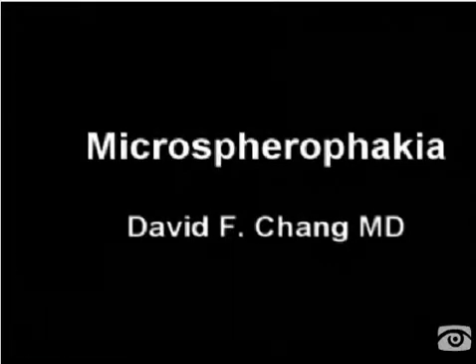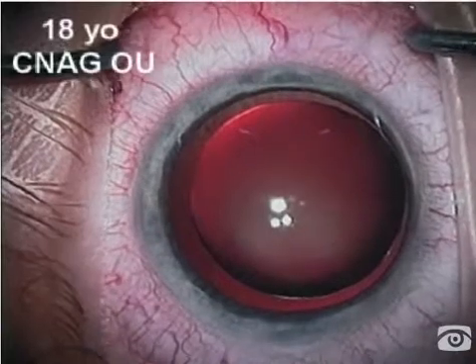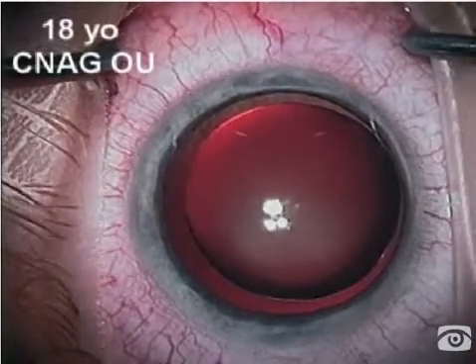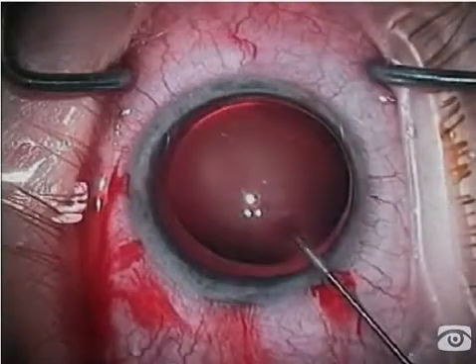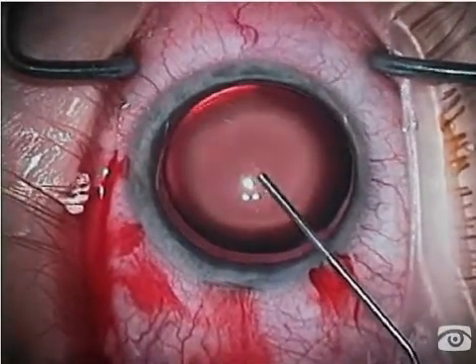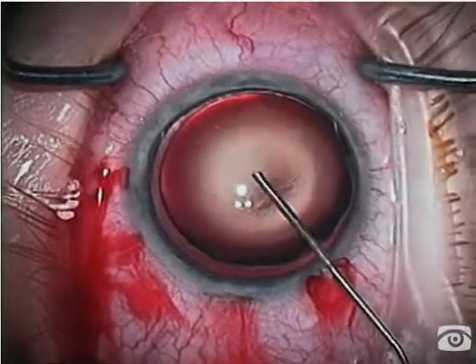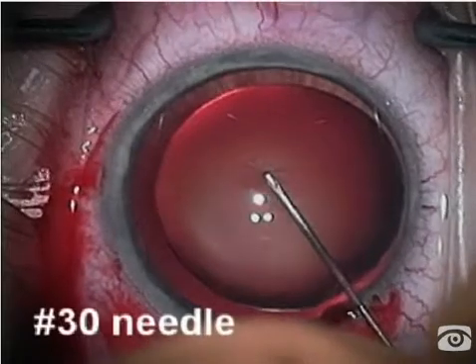Lens removal was scheduled on this 18-year-old high myope with chronic angle closure, uncontrolled pressures, and a flat chamber. After dilation, we have a case of microspherophakia. The lens diameter is very small and the AP depth is very large, causing the shallowing of the chamber.